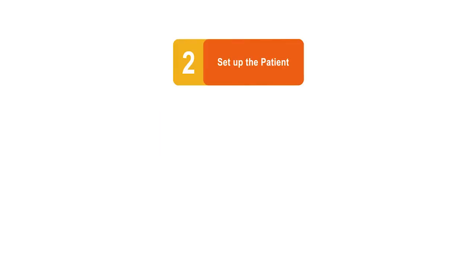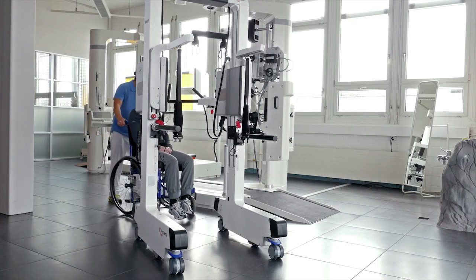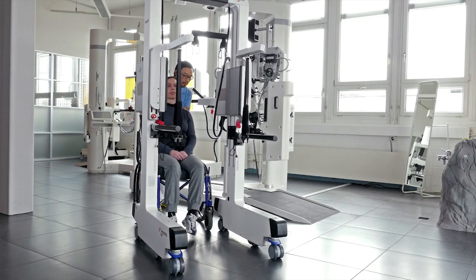Set up the patient. Place patient in Andago. Lift the patient. Adjust body weight support. Adjust fall limit. Place patient in Andago. Andago enables easy setup for patients in wheelchairs.